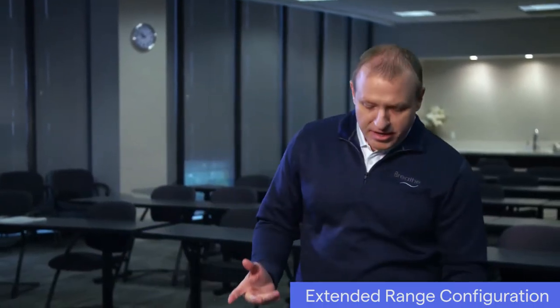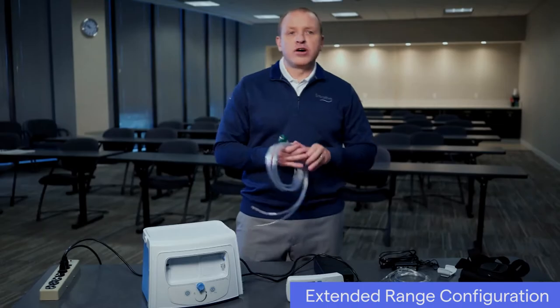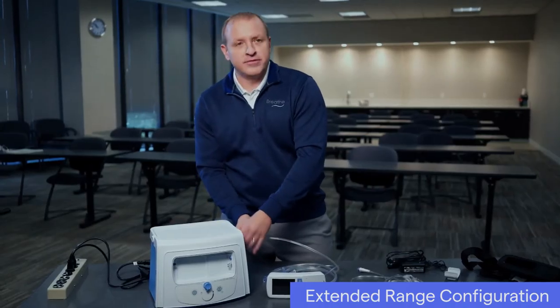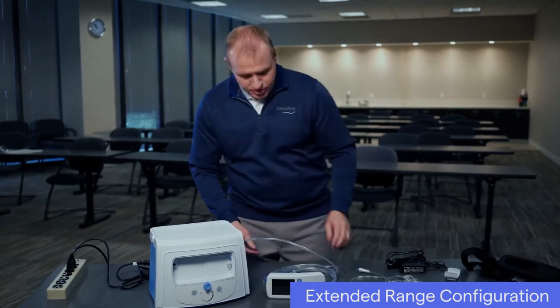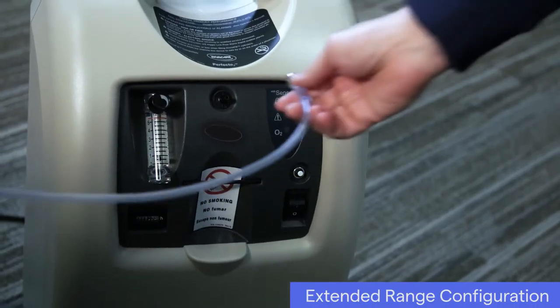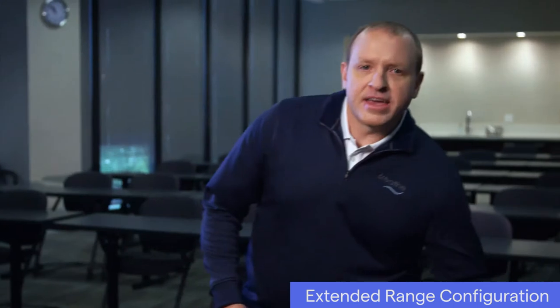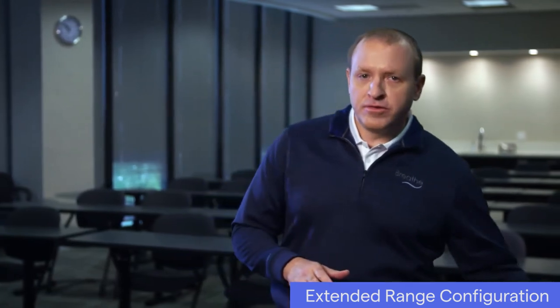We're now ready to set up the ventilator in the extended range configuration. With both the compressor and the ventilator powered off, connect the green connector on the Combo 2 hose to the compressor outlet fitting. Once connected, connect the Combo 2 hose's oxygen tubing to the oxygen concentrator. If you choose to use the black carry case for carrying and securing the LIFE 2000 ventilator, it'll need to be placed in the case prior to connecting the ventilator to the compressor.